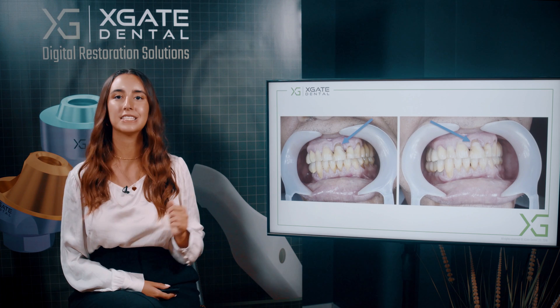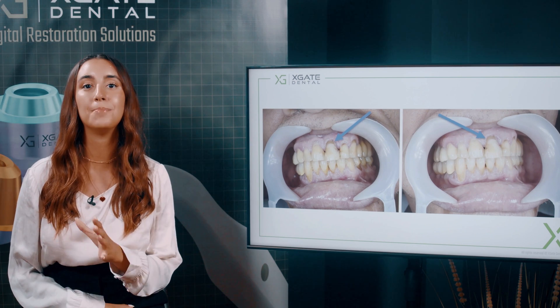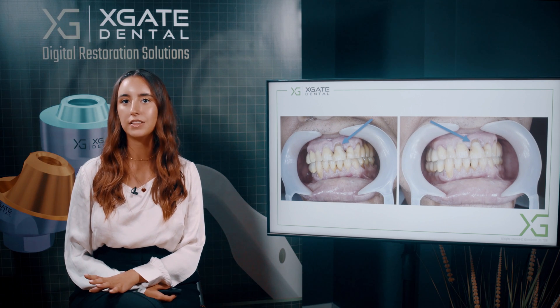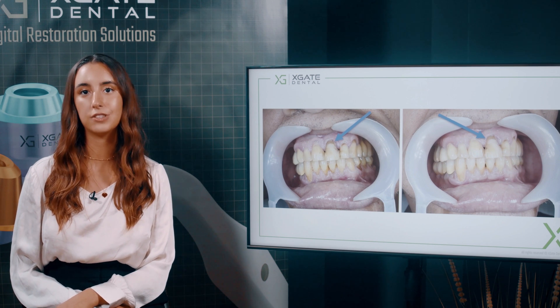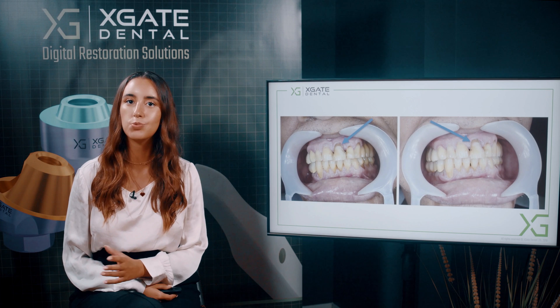Today we are going to discuss a case where we used implants for temporary restoration and made the restoration something like a Maryland bridge. It's something that is not widely used, but it's a great solution when you have already had the implants, you extract the tooth, and then you need to replace the tooth somehow.